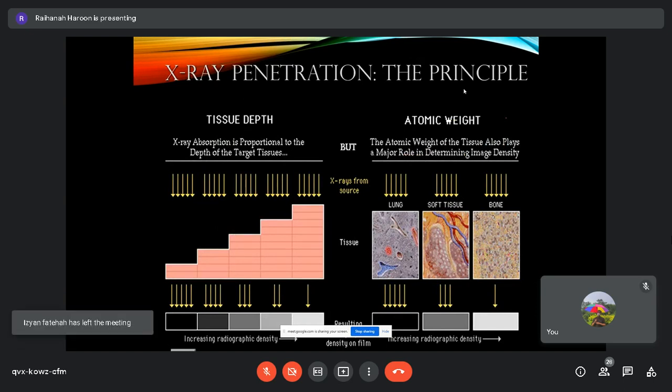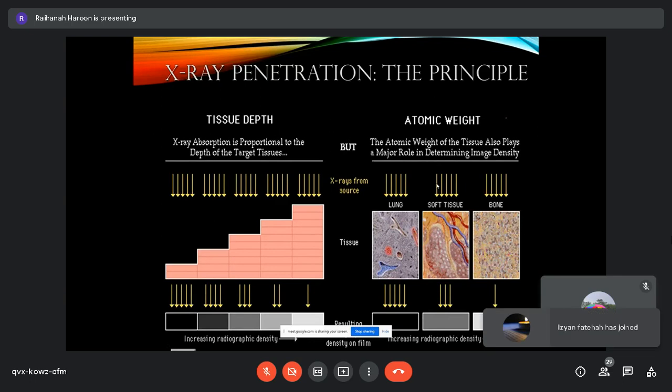Okay, just now at the beginning of my lecture, I explained how different atoms have different atomic weights: carbon, hydrogen, oxygen, and even if the patient has a metal bracelet or susuk or anything like that, all those things are dense, hyperdense. Most of it is made from metal, so it will have a higher atomic number. If you check your periodic table, metal will be at a higher atomic number. So this explains this.